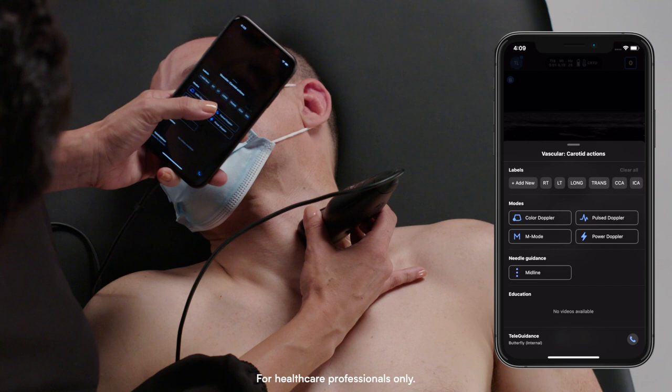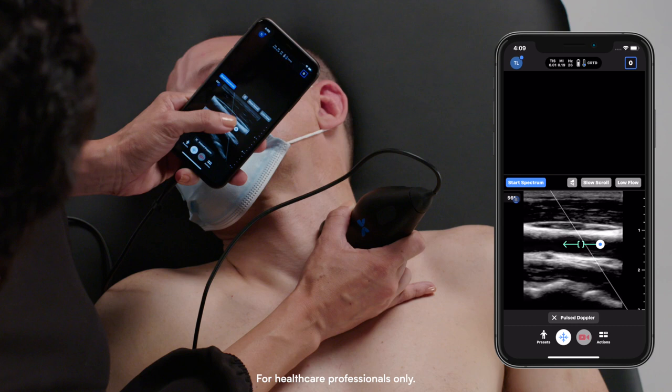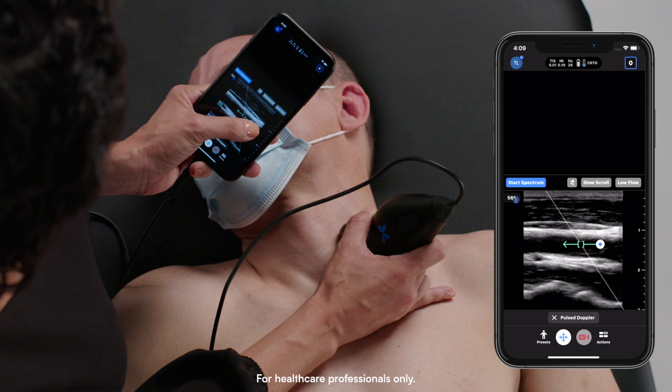I'll turn my probe in long axis and I will place the sample volume in the center of the vessel. I can also adjust my angle by tapping on the white circle and you can see the angle change.